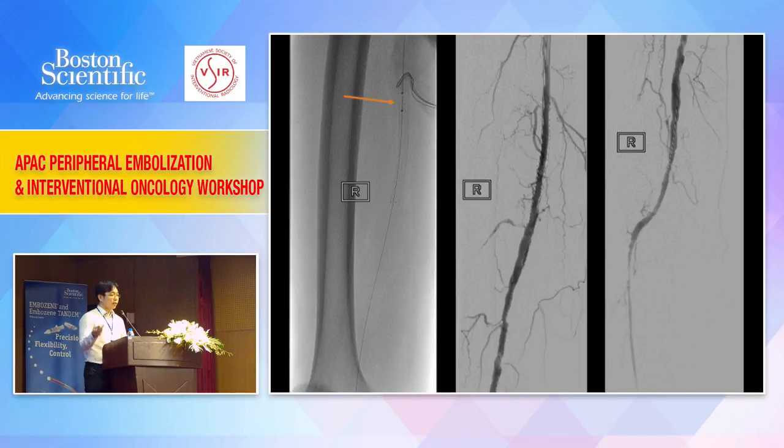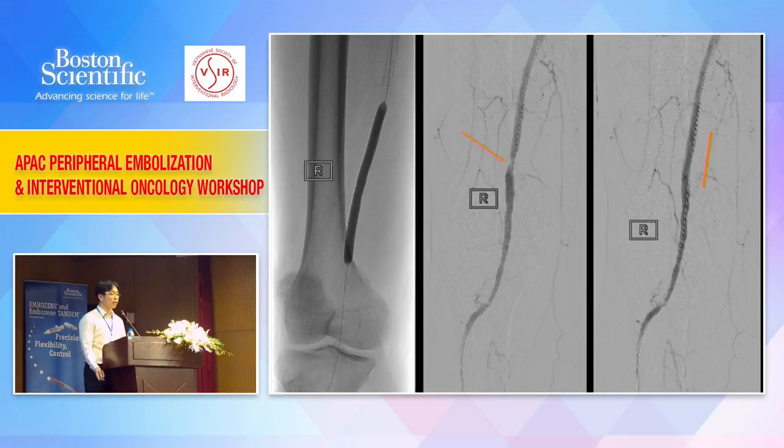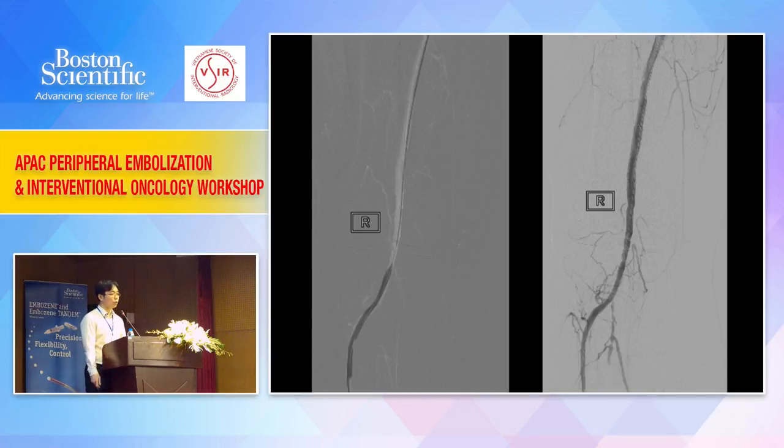We started to jet a little bit of the clots which is above the stent, and then see where the offending underlying lesions are. Balloon angioplasty, do the stenting, which are all the adjunctive procedures that we need to do. And then we do a drug-eluting balloon, which is just around the knee joint, and then voila, you get a nice re-inflow, recanalization of the entire occluded segment. This takes you less than 2 hours to do. It's a one-off. You don't have to put any thrombolysis catheter across.